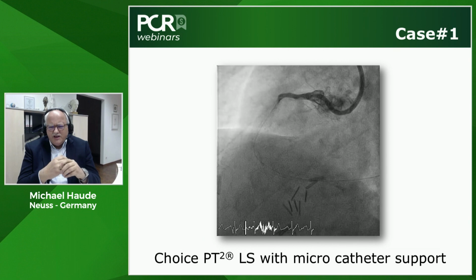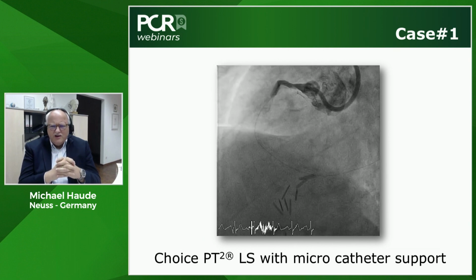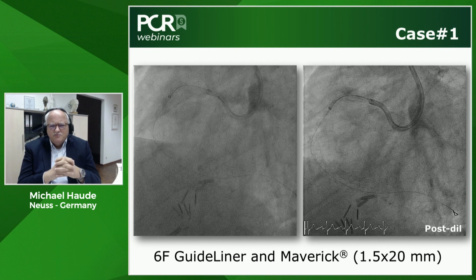So our intention, on the next slide, was to predilate this lesion first. And we had to do that. Can you go to the next slide, please? We had to do that with a small balloon.